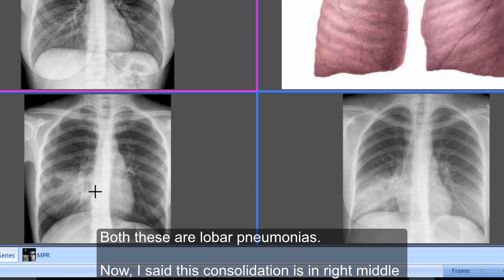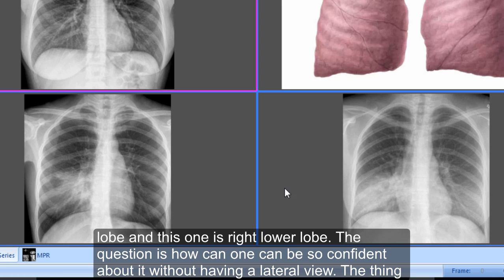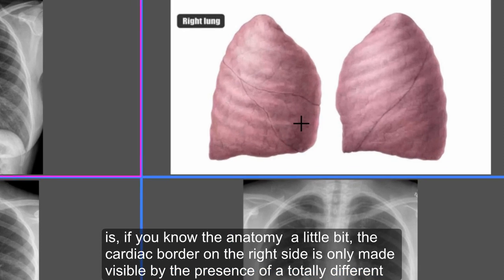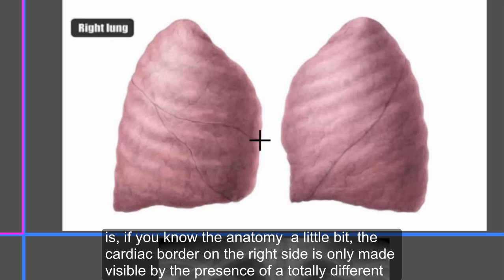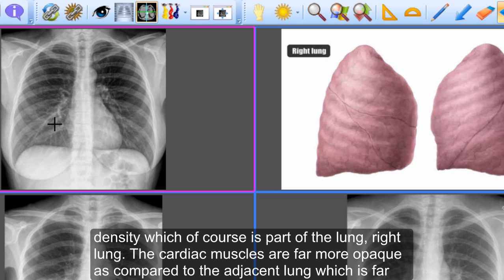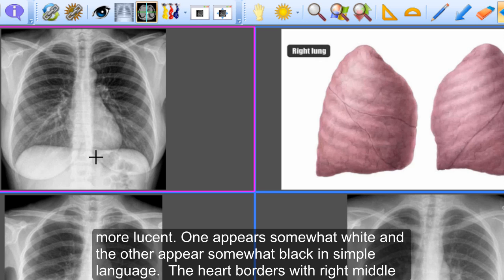The question is: how can one be so confident that this consolidation is in the right middle lobe and the other in the right lower lobe without having a lateral view? If you know your anatomy, the cardiac border on the right side is only made visible by the presence of a totally different density — which is part of the right lung. The cardiac muscles are far more opaque compared to the adjacent lung, so one appears somewhat white and the other somewhat black.